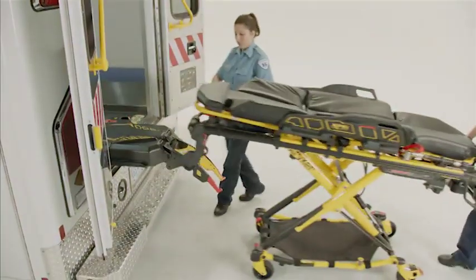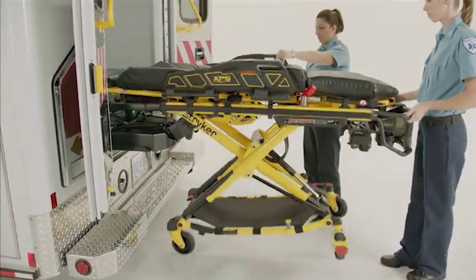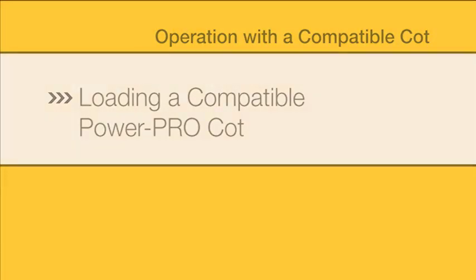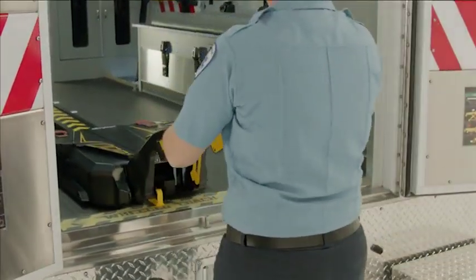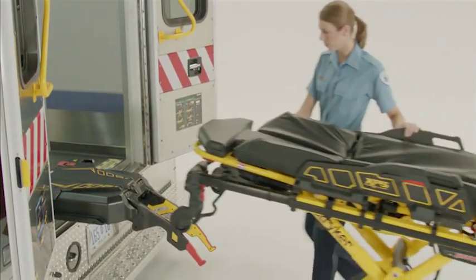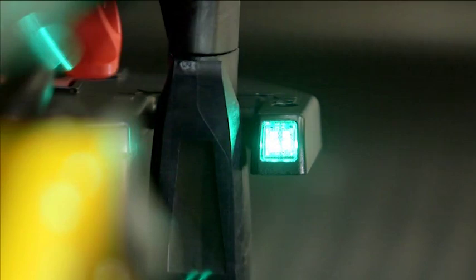The following segment will guide you through the operation of the Power Load system with a fully functional compatible PowerPro cot and Power Load system. To load the compatible PowerPro cot, first guide the Power Load trolley out of the patient compartment. Raise the lifting arms and guide the trolley out of the ambulance until the head-end LED indicators flash amber. Press and hold the plus button on the PowerPro cot until it automatically stops at the load position. Guide the cot into the trolley until it is in position. Note that the head-end LED indicators turn solid green when the cot is in position.